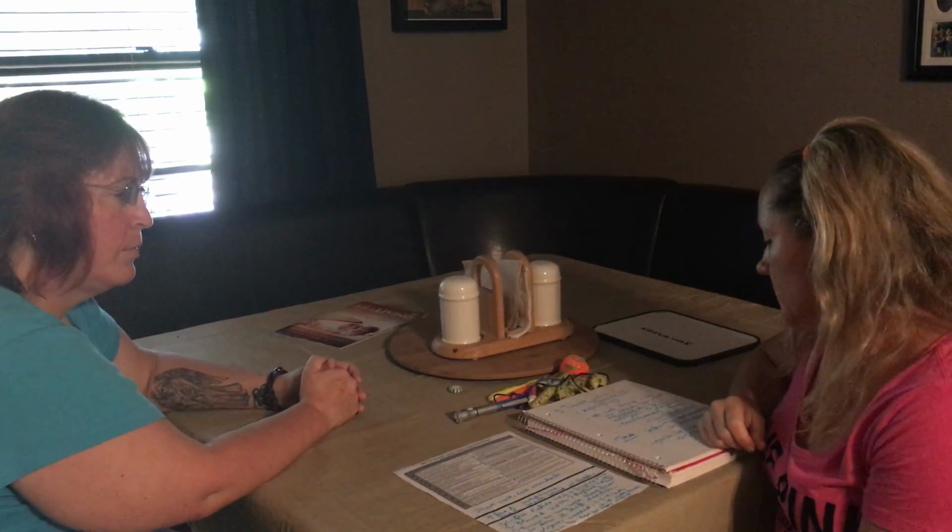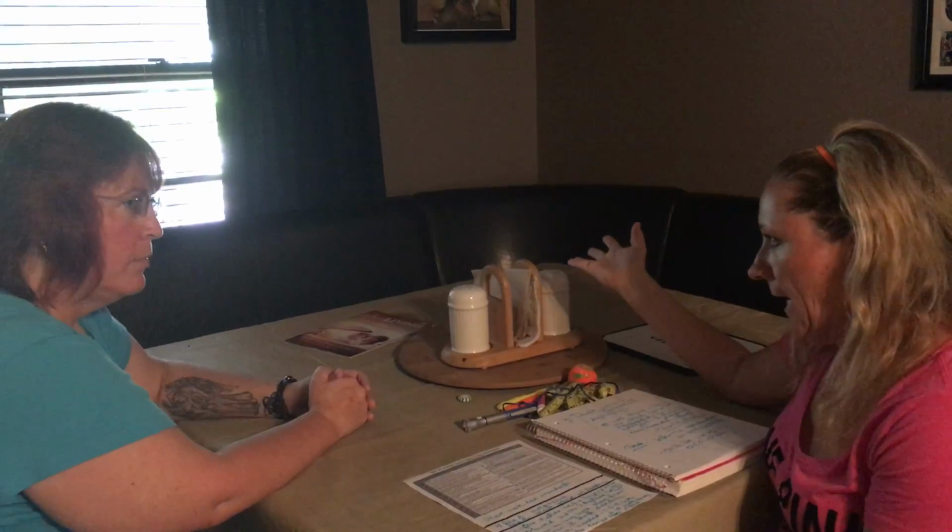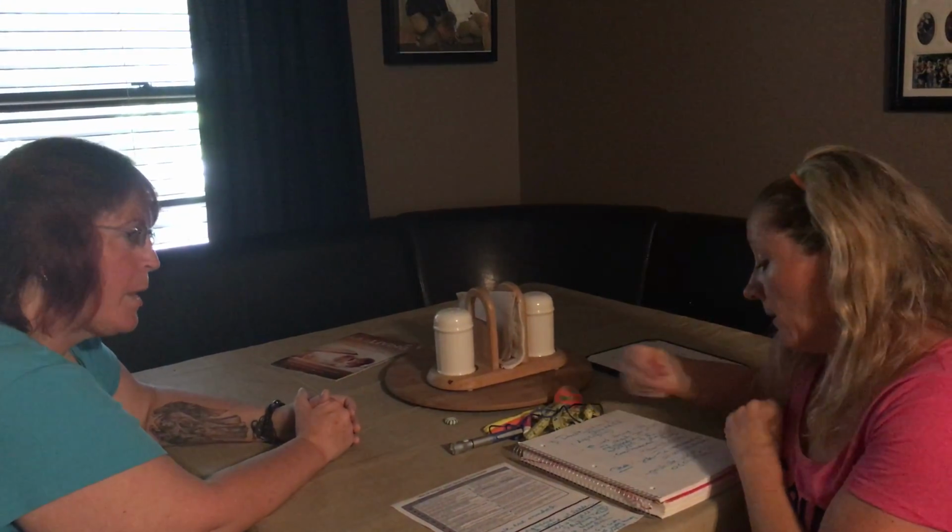Like when it's a little darker and I'm trying to read. Okay, and when you're trying to read. So that all can have effects. For example, once again, on driving, when you're trying to drive and identify things around you, or when you're reading, let's say when you're studying for something, or you're trying to check your children's homework for correctness, or you want to correct them in any way, but you cannot really read it because it's handwriting and it's a certain size. So then you can use the magnifier again.